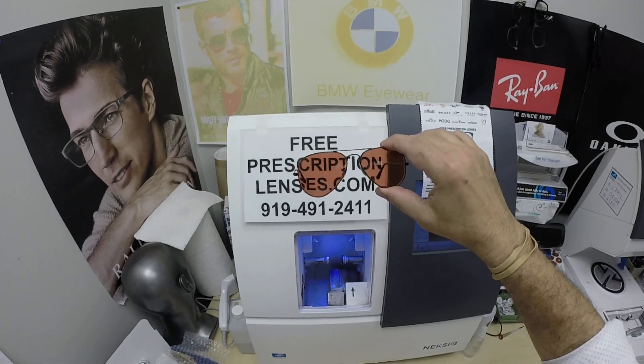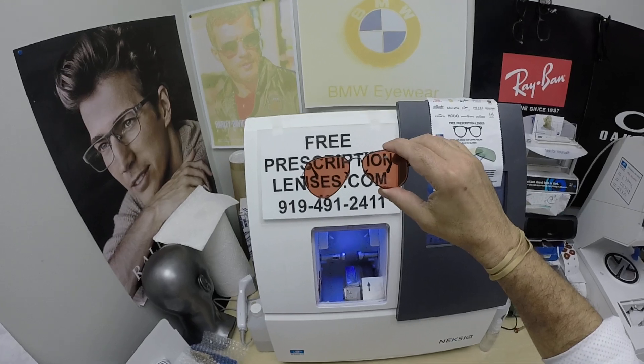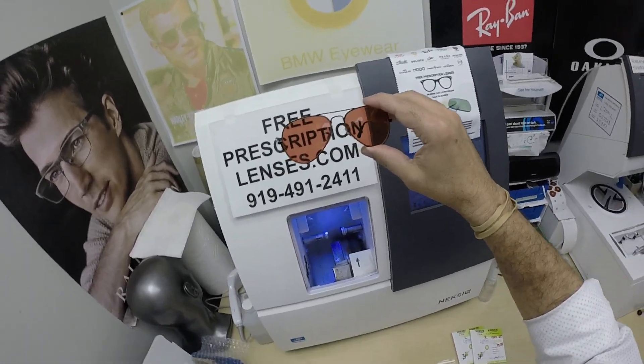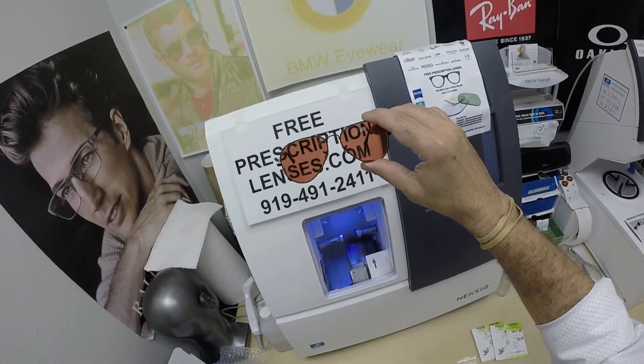I can tint them — it usually goes as light as 25%. Generally it's about 50 to 60% for indoor use. She wanted them sunglass dark for when she's outside. These just were not getting the job done, even in polarized, so I said we could do this for you.